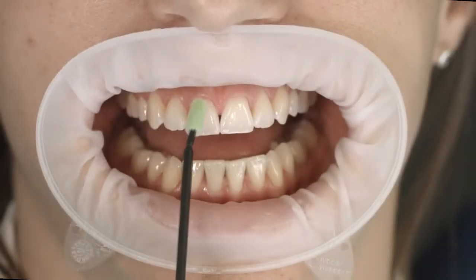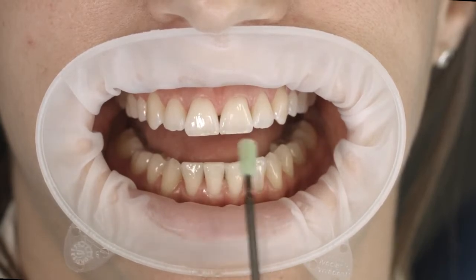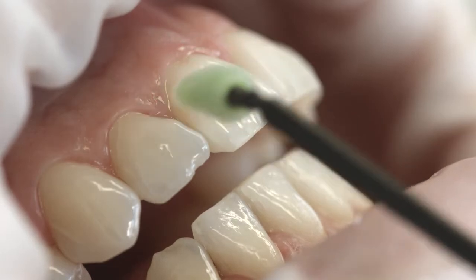Use a VivaBrush G applicator to apply the varnish. A thin layer of varnish is sufficient to provide the teeth with an optimum amount of fluoride. Apply the liquid varnish selectively to risk sites. From there, the varnish flows directly into the proximal areas.